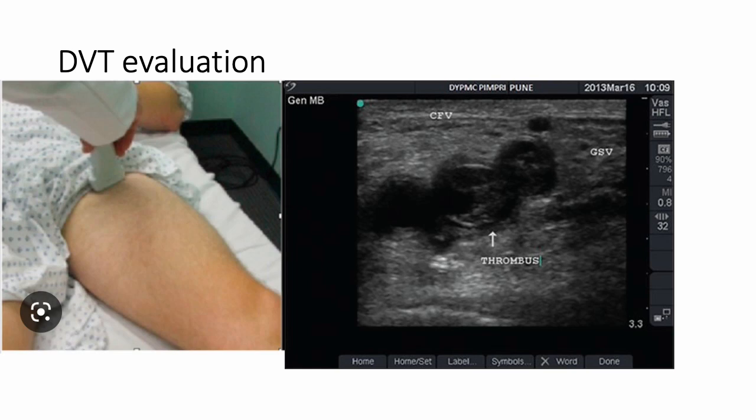And I'd urge you, if you have any discomfort identifying thrombus on ultrasound, as you are ordering DVT studies on patients and get positives, I would urge you to actually pull those images up, look at them, and see what they look like when the ultrasonographers are doing their studies to get more comfortable with how thrombus looks in the veins.